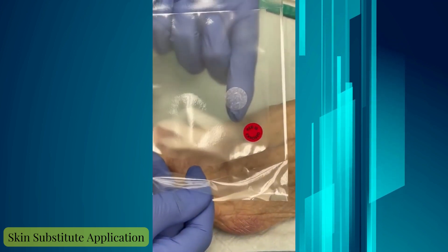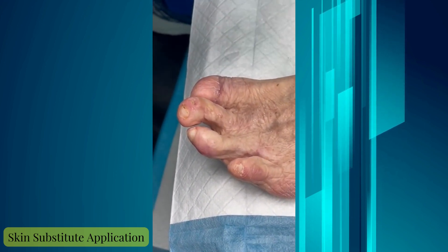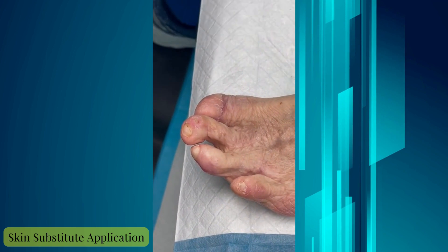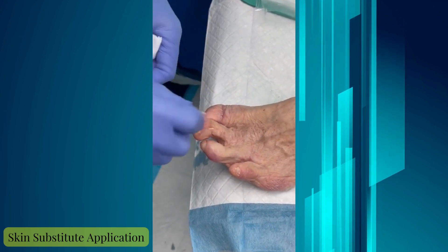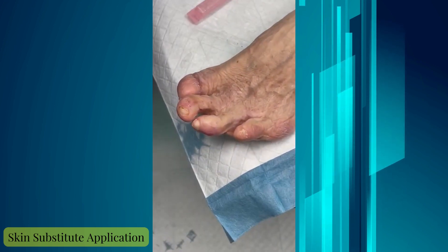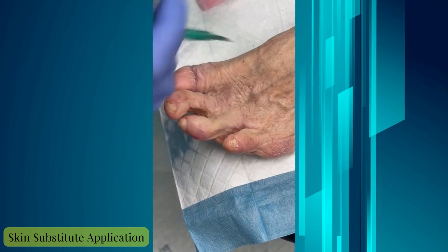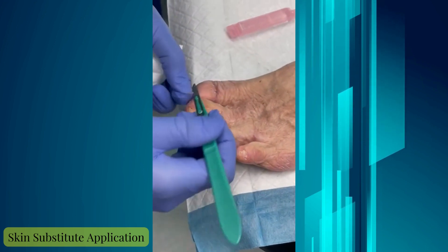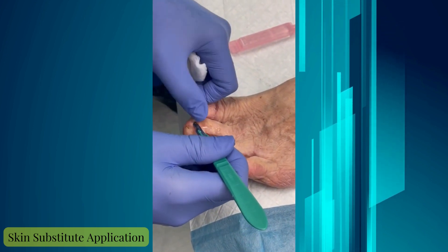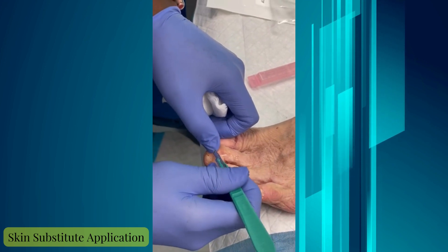You can barely see it right there. What we're going to do with this graft — because it's a little larger than the wound — we pack it in layers to fill the defect, because there is more depth to this wound.